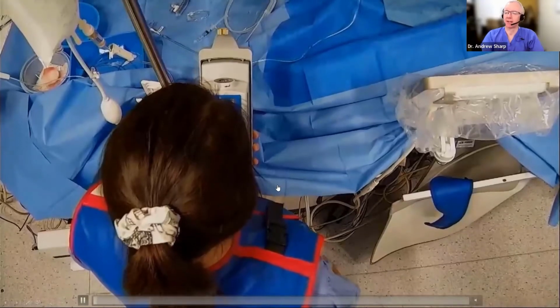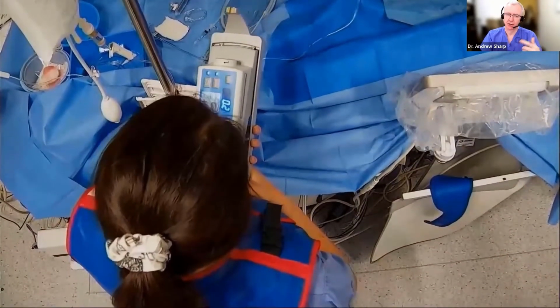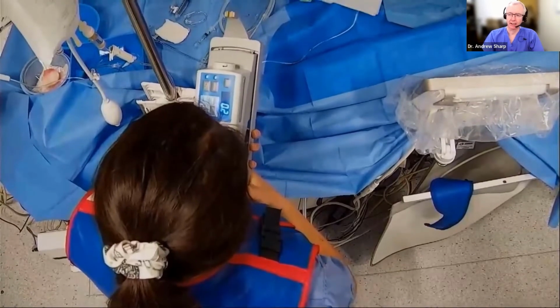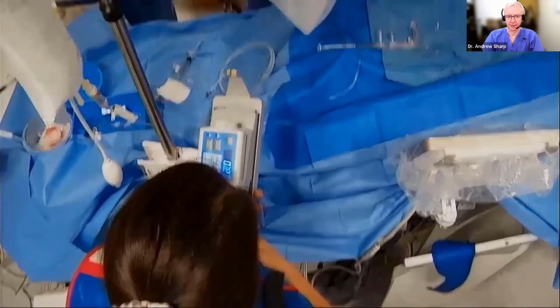Okay, so I've got a video here just on prepping the IVUS, and I'll talk over it while we start. We're going to use the Refinity in this live case, and it's a rotational device. It's a 45 megahertz device. It's very low profile. It'll go very easily down a 6 French catheter, and it goes over a wire. It's got a very short monorail segment.